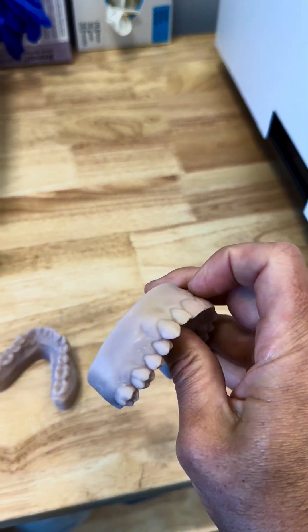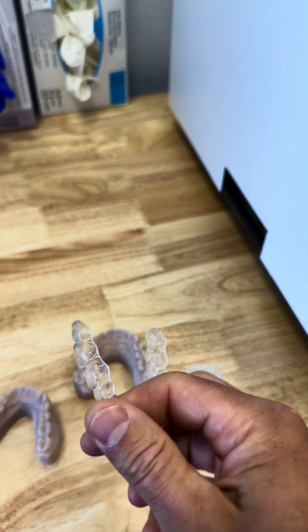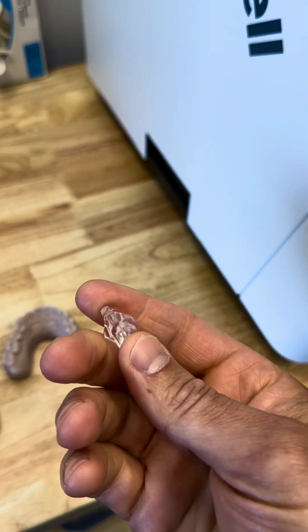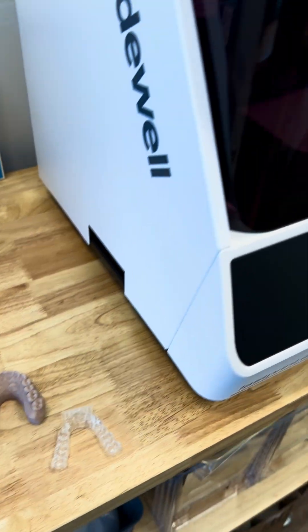So this is dental models. We can build retainers, aligners like you would use to move teeth, and other types of night guards. Lots of different types of appliances and night guards we can build. So anyway, that's it — that's the printer.